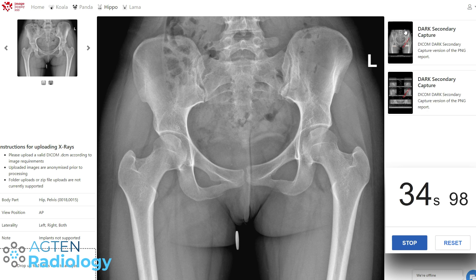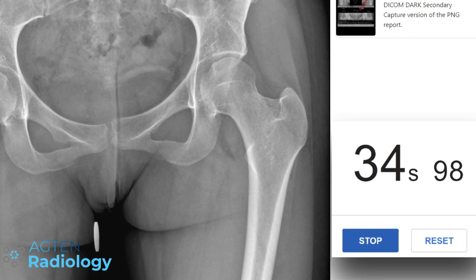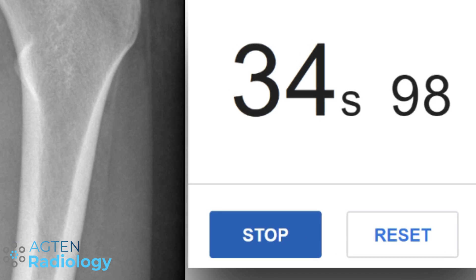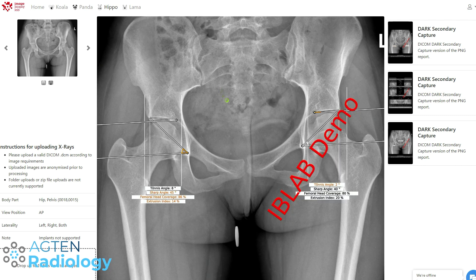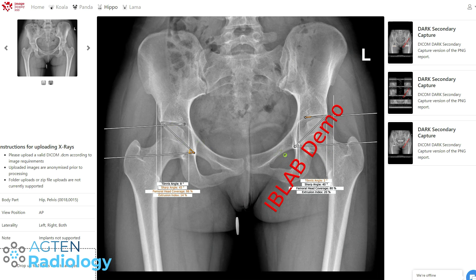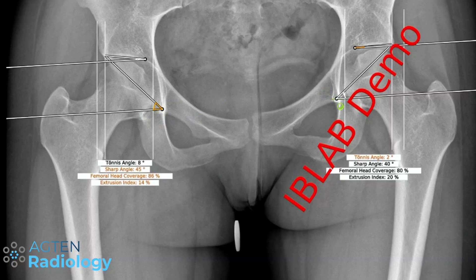Okay, so these are now the results — it was quite fast. I had a chat with the team and they told me this is also the speed you'd get in a live environment. This is labeled as a demo, but this is actually the radiograph we just uploaded. You can see how it placed all the markers, how it's identifying anatomic structures, and also it corrects for the tilt of the pelvis — so it's not just measuring to the horizontal line. That's already good. Then you can see the extrusion index here.